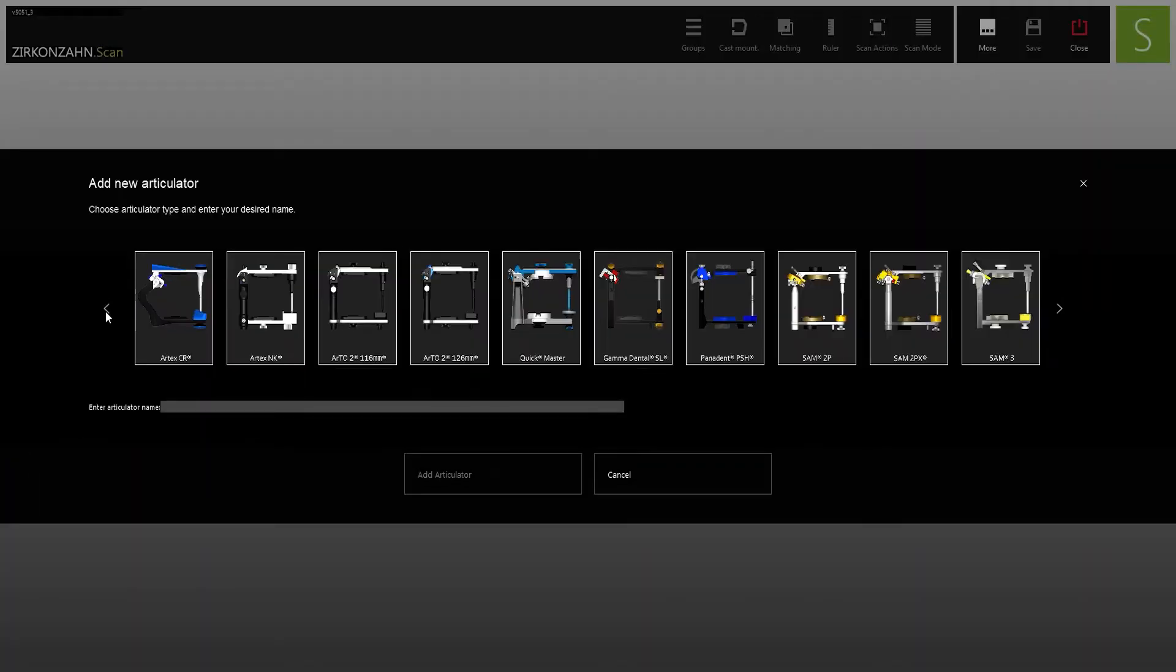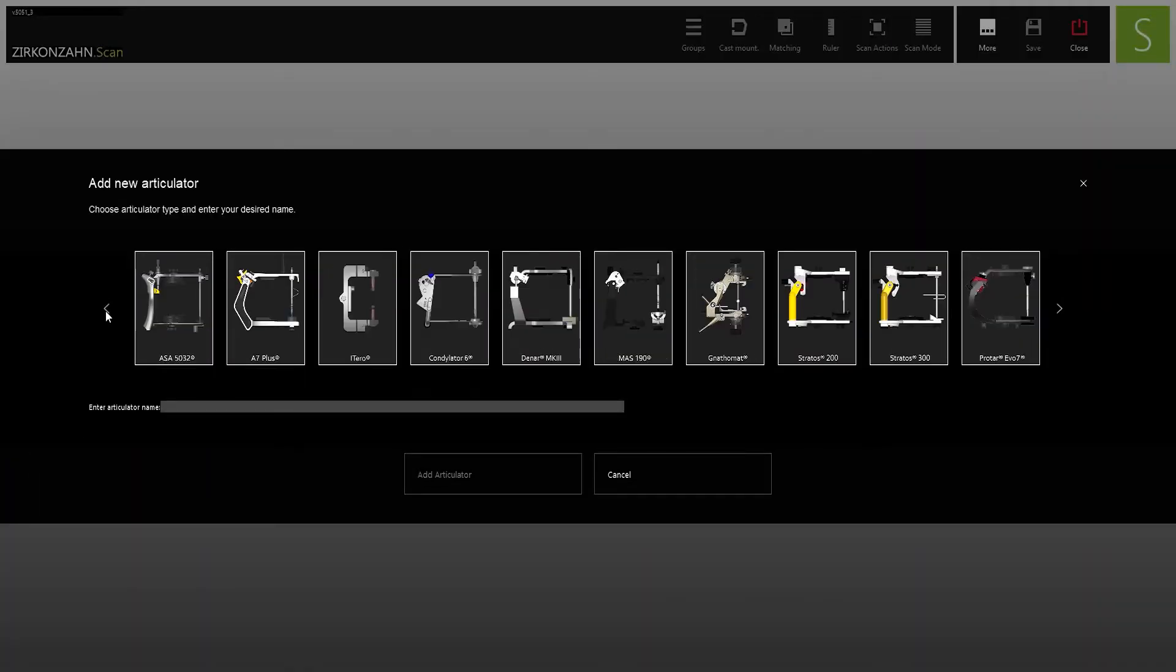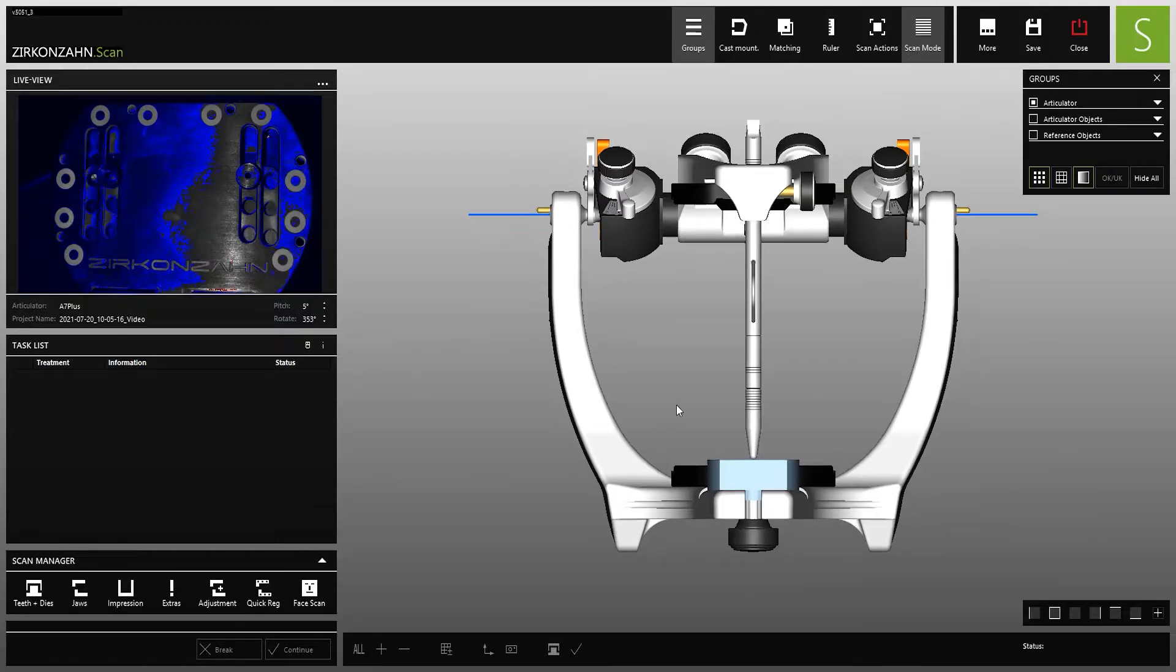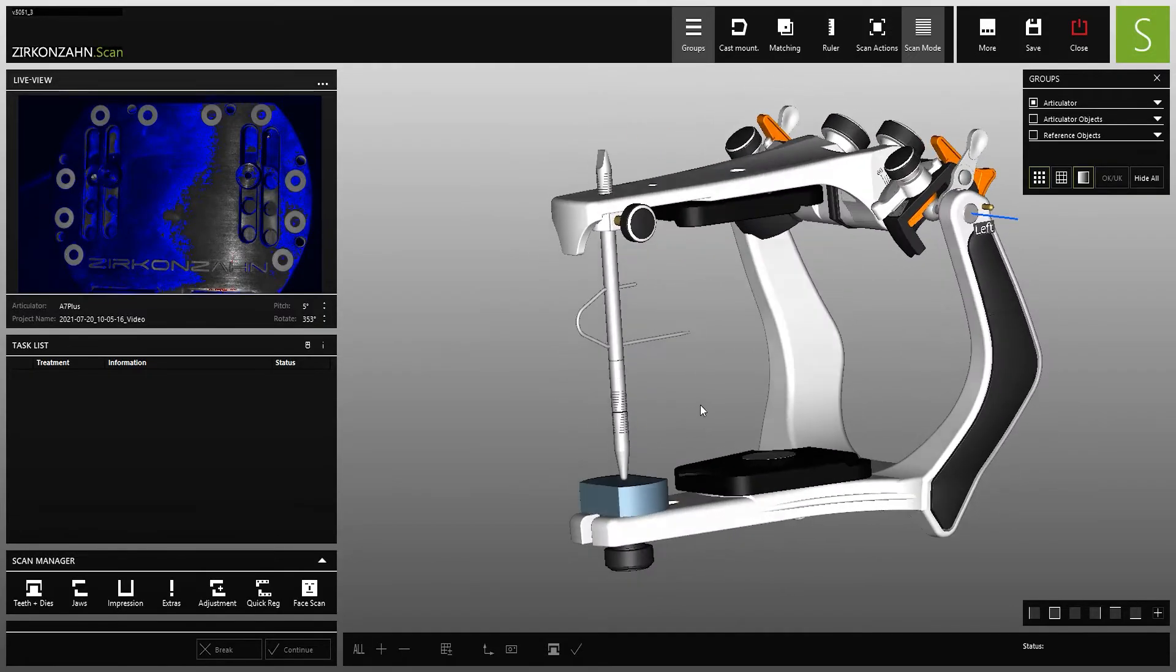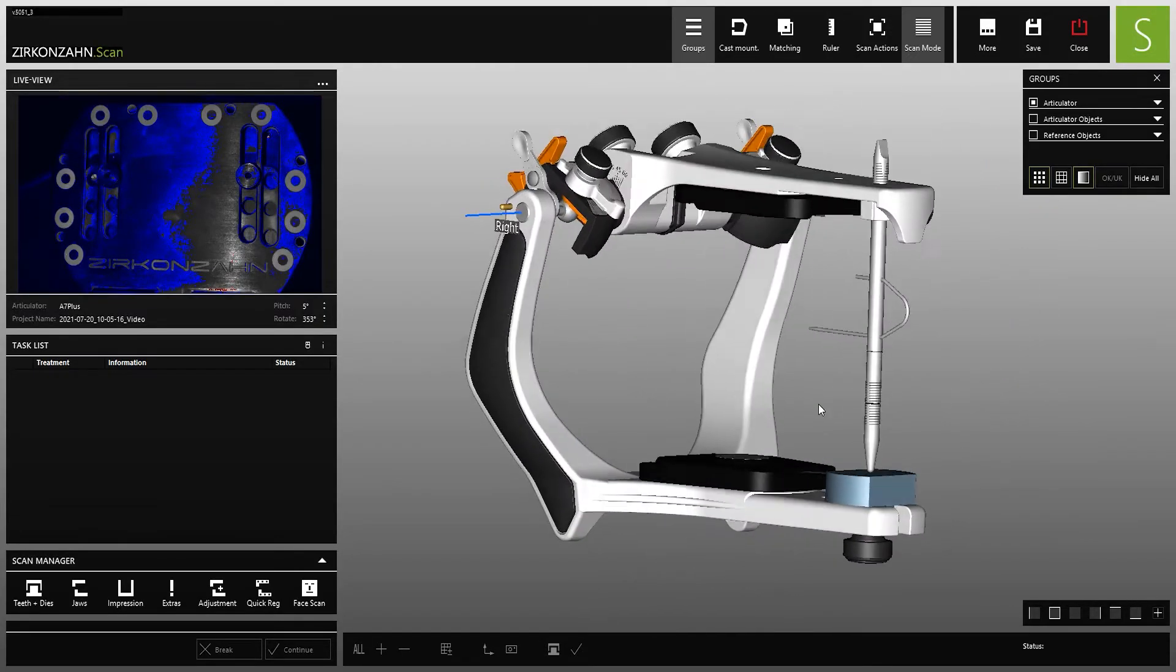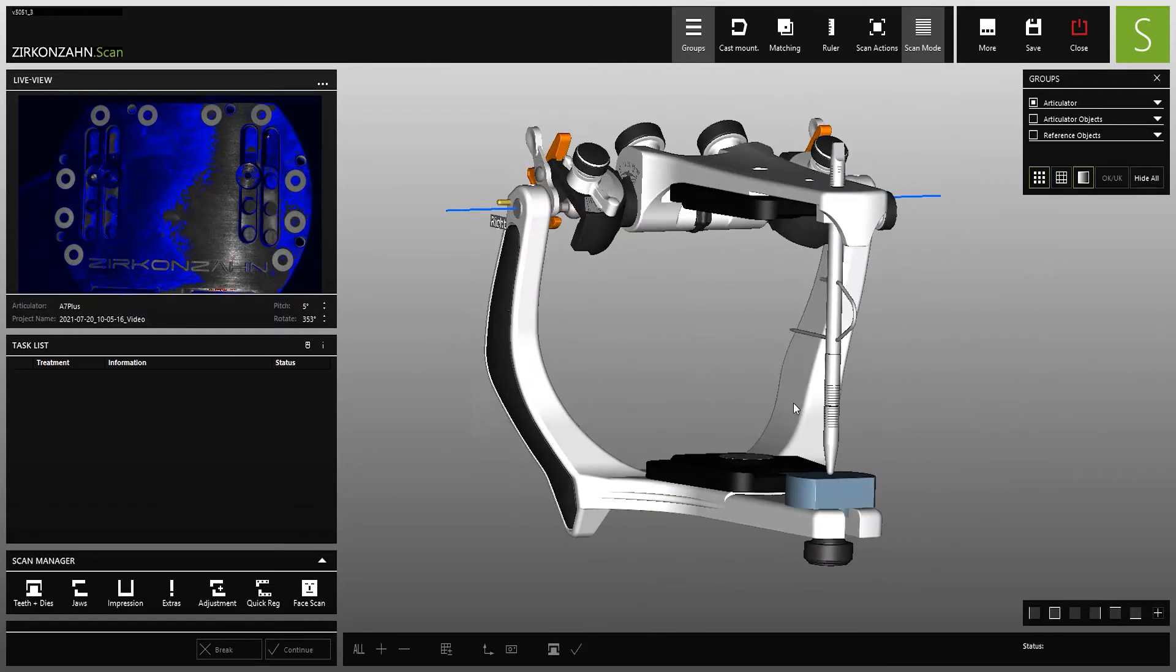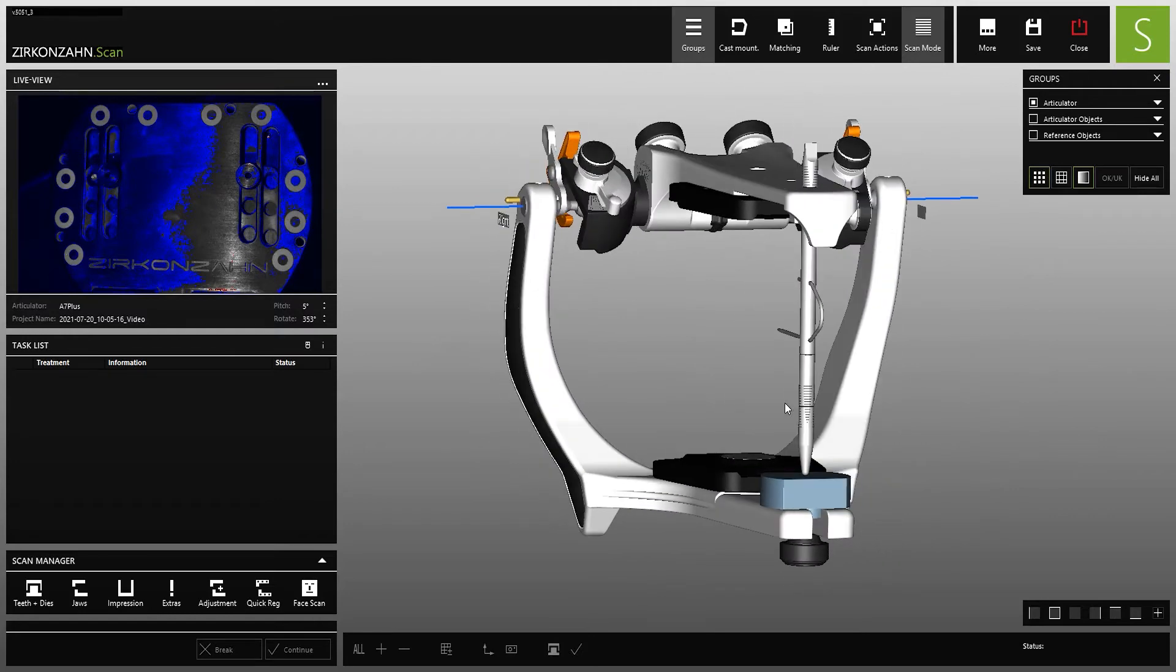The software already provides a large selection of different articulators, but you can also register additional articulators via the model position detector in order to automatically align the scanned models in the right position.